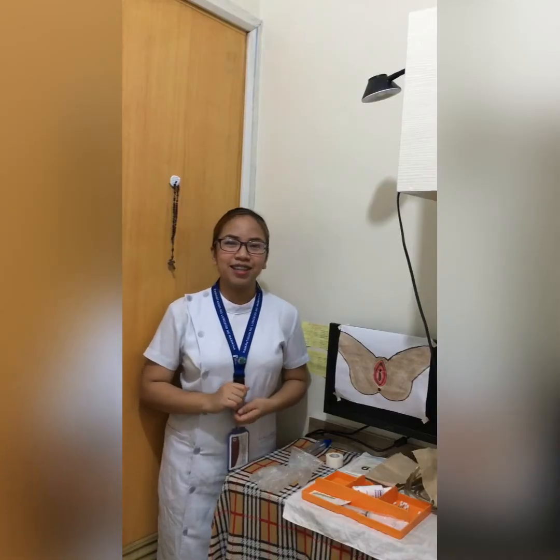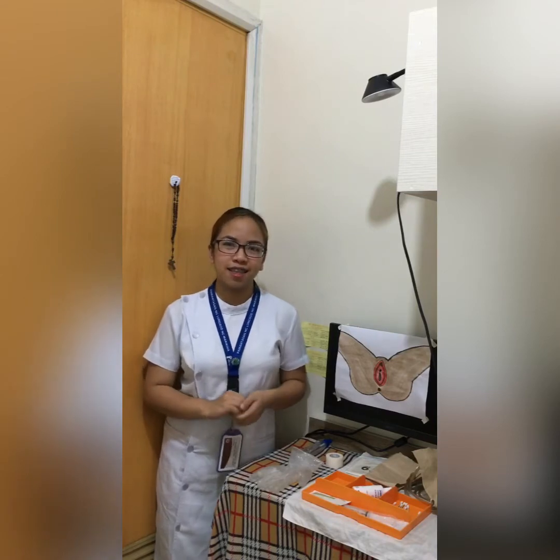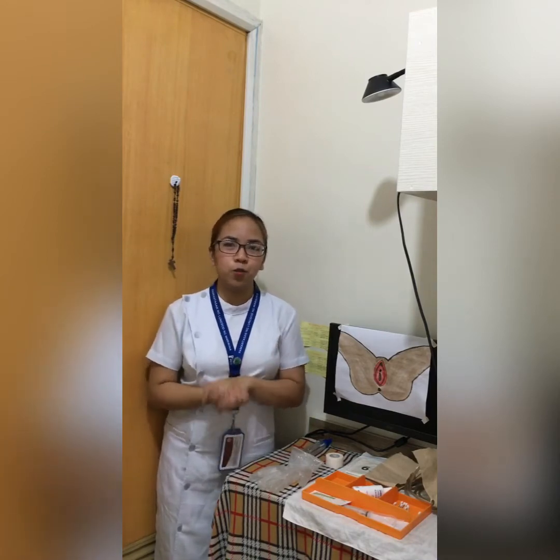Hi, I'm Daniel Hershey's Espelita, and today I'm going to perform the female urinary catheterization. The urinary catheterization is the introduction of a catheter into the urinary bladder through the urethra.